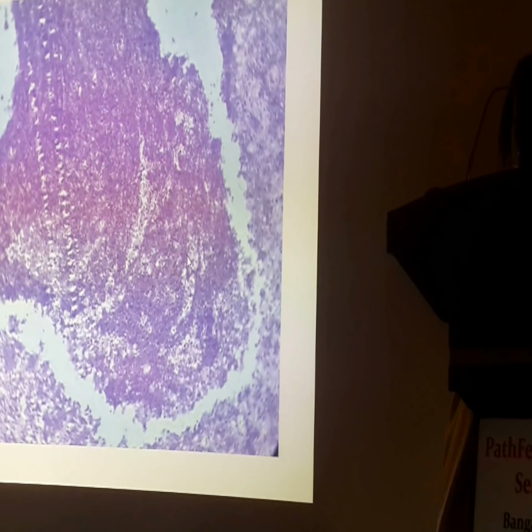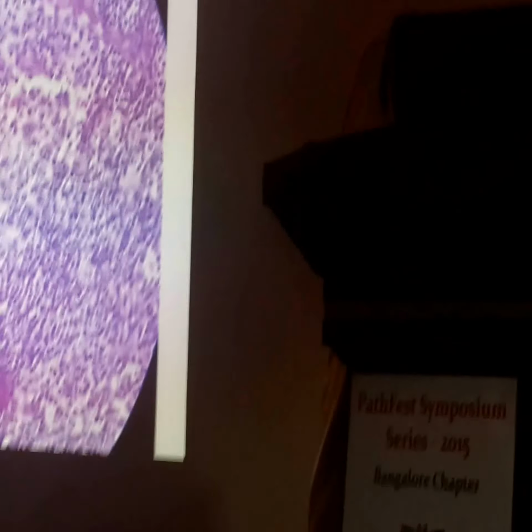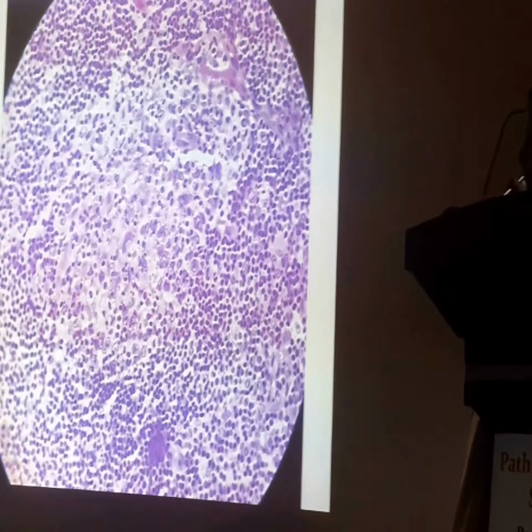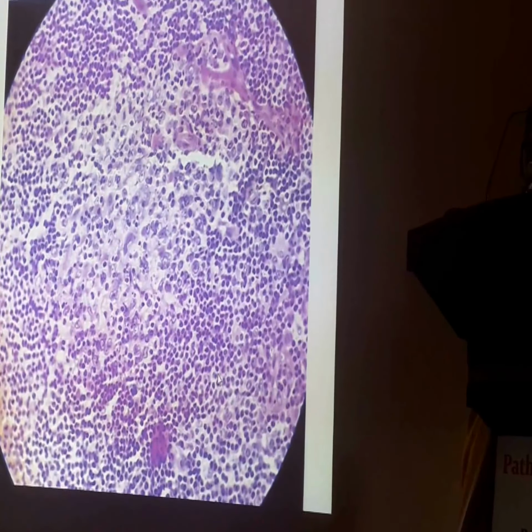This looks like there's necrosis also. There's an area of necrosis. The follicle which you saw, does it look benign or malignant? Benign, yes, it's a hyperplastic lymphoid follicle. Next.